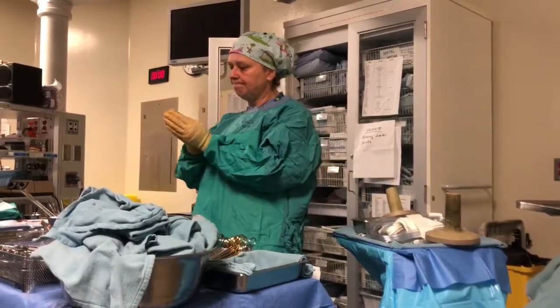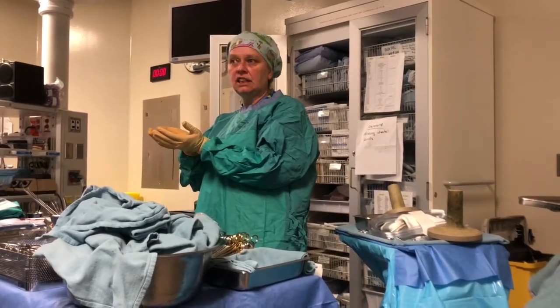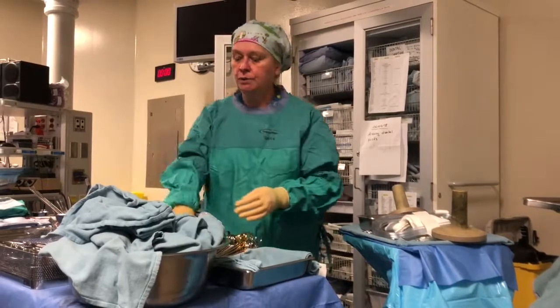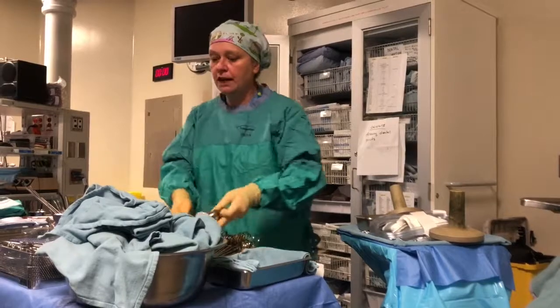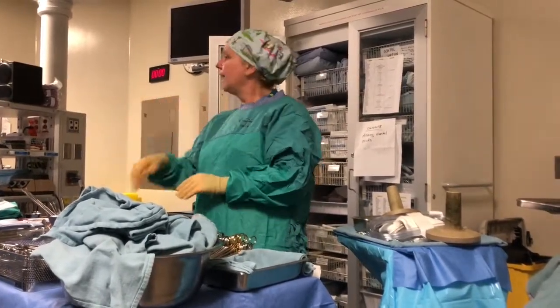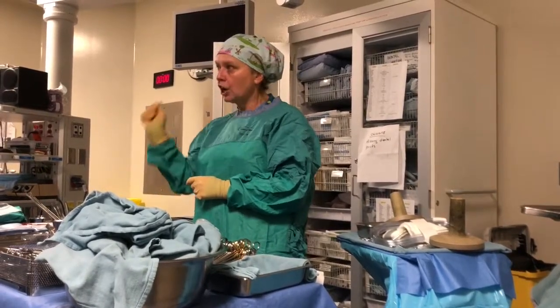And it's like a jelly, solid jelly that's in there, solid, right? But once they move that out, so I would put this up for them to put it in, right? Once they move that up, there's going to be little bleeders underneath at the very bottom of that aorta, and that's when you need your silks. They'll need the silks right away, right? They got to stop that bleeding.